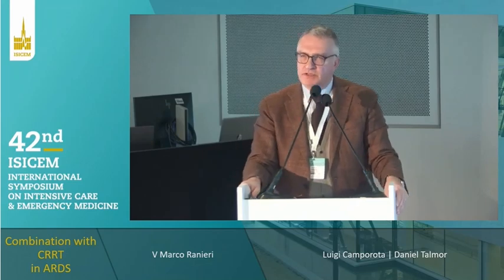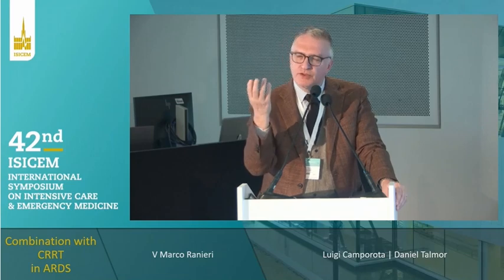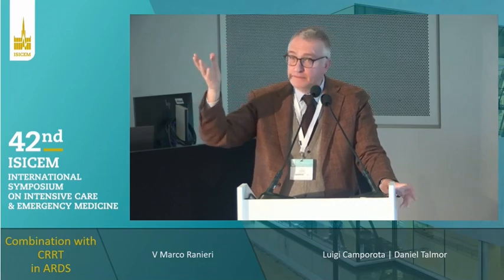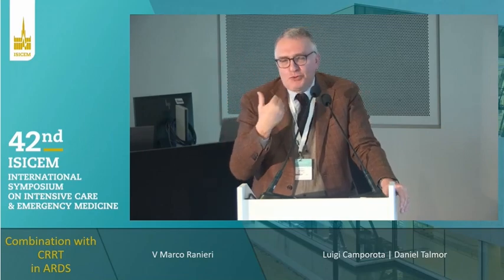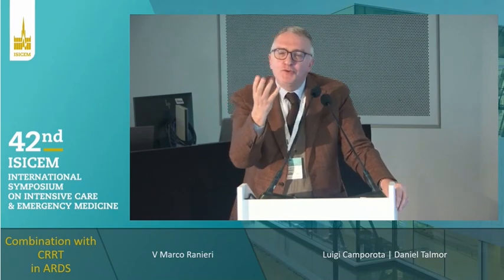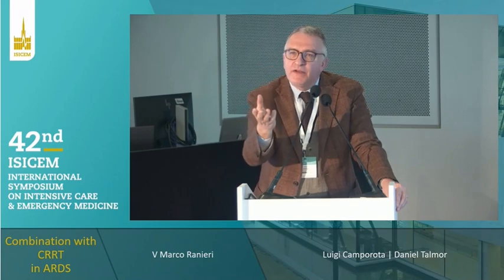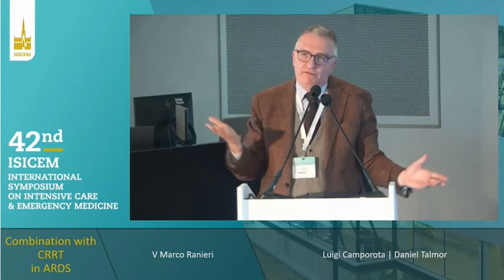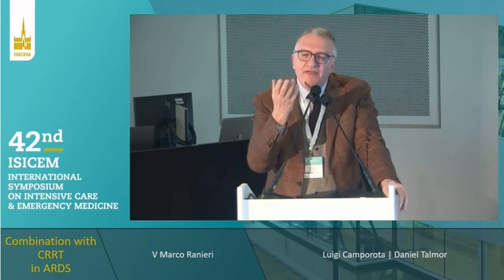You see the SUPERNOVA trial, for example, in patients with mild to moderate, moderate to severe ARDS: we know that with that technology, half a liter is not going to work. We know that we have to use higher blood flow. Now you should ask the principal investigator of the REST trial why they did the study with half a liter when he was one of the authors of the study that showed that with half a liter of blood flow, you don't obtain the target super-protective tidal volume. But that's life. You started the trial, and it's a matter of luck. But I think we have enough data.